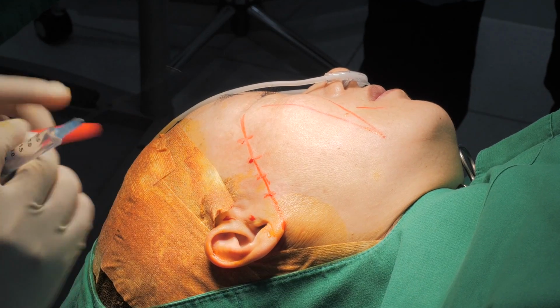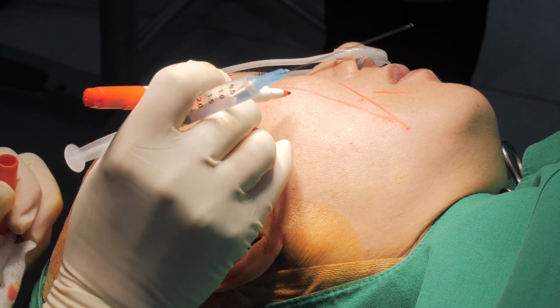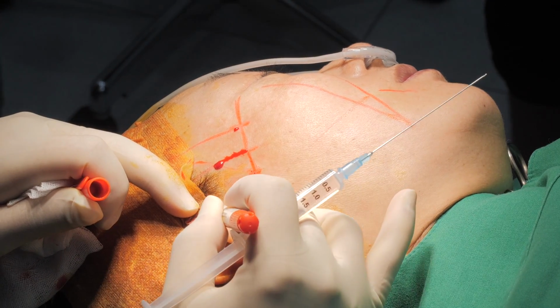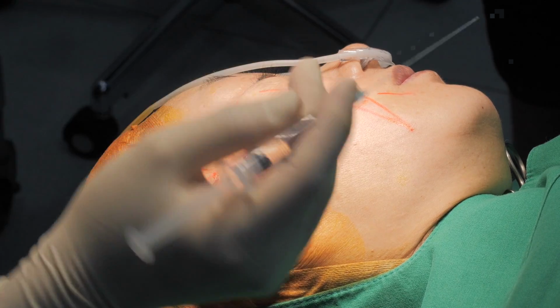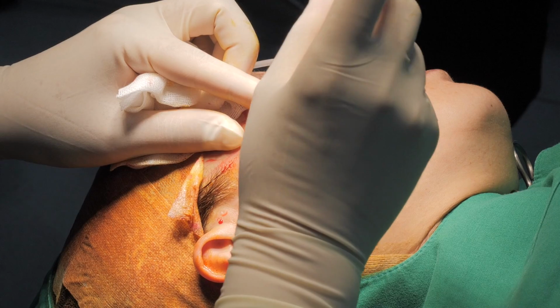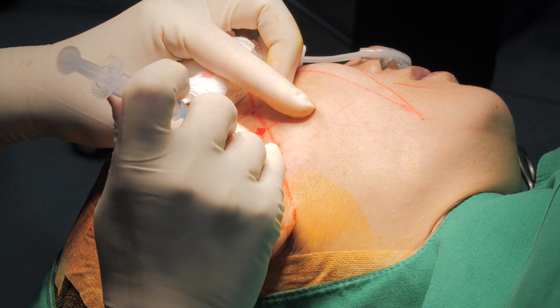Well, I will insert 2 threads this way. Do you remember? 2 more threads this way, and add 1 more again. 1 dual leader thread this way. 1 more. Anyway, I will explain one by one. First of all, I will infiltrate tumescent solution along the pathway of the thread. It can reduce the pain and even bleeding.